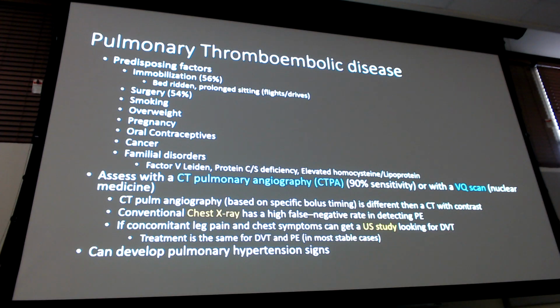Okay, chest X-ray is still going to be an initial study. Why? Because what if it's not a PE and it's something else? I will tell you that there are a couple of things in the textbook that say if you see this, you think PE on a chest X-ray. Clinically, I've seen multiple PEs in my life. I've never seen these X-ray findings. But it's in the book, so I gotta tell you about it because it could be a pants question of what X-ray finding would lead you to suspect the pulmonary embolism in a patient. So you gotta know what it is.